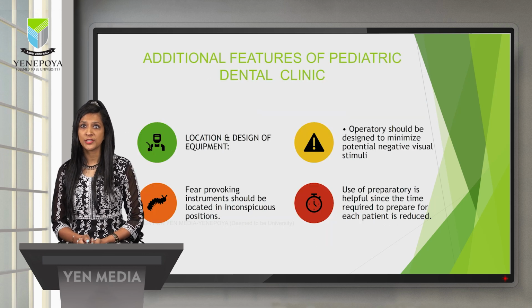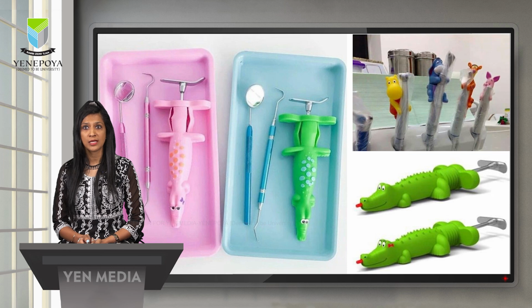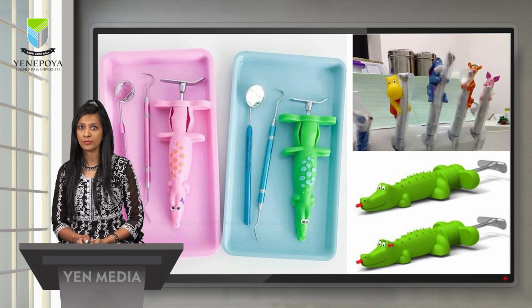There are a few additional features of pediatric dental clinic, which is the location and the design of the equipment. Now, the operatory should be designed to minimize potential negative visual stimuli, and fear-provoking instruments should be located in inconspicuous positions. The use of preparatory is helpful since the time required to prepare for each patient is reduced. Now, the instruments that we use for the child should be accommodative to the child and not vice versa.